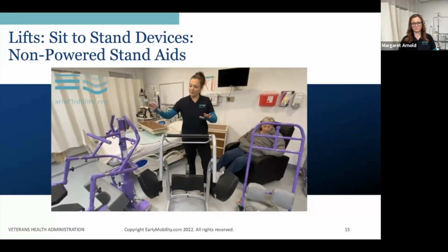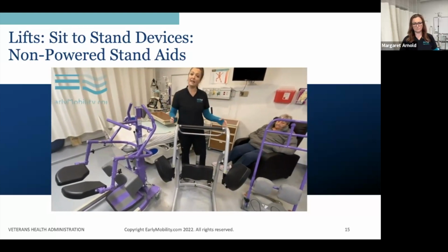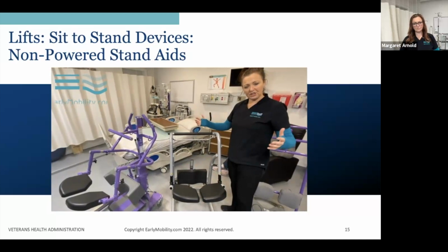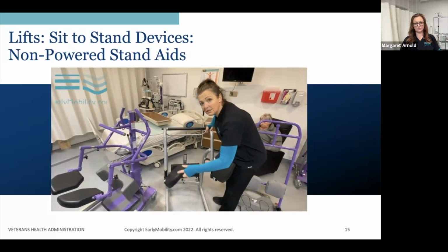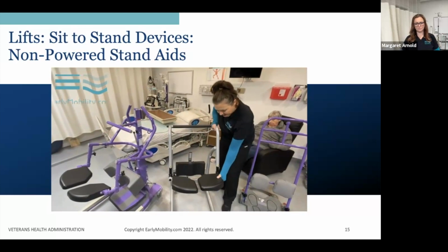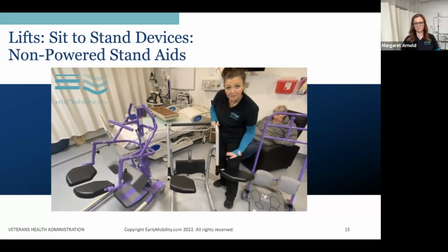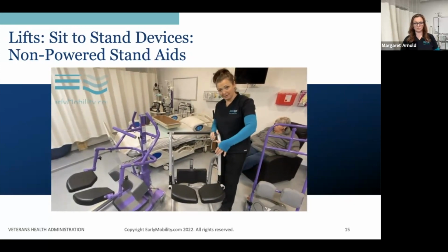Lastly, these two models have seats that flip down behind them. The mechanism of the flip of the seat is something else you want to look at. Sometimes if you have patients with wider hips, it can be difficult to lift these flaps up in this manner. So both of these models have an alternate way of raising the flap or getting it out of the patient's way so that you can get the patient in and then put the flap in behind them.